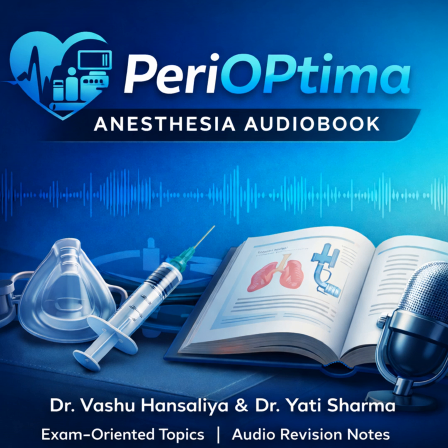That's the danger. Imagine a patient who is in pain and wants to breathe 30 times a minute. In AC mode, they trigger 30 times. The machine gives them 30 full 500 milliliter breaths. That is a massive amount of ventilation. Hyperventilation. Severe hyperventilation. They'll blow off all their CO2 and develop a severe respiratory alkalosis. Plus, they might be breathing so fast they don't have enough time to fully exhale. That leads to air trapping, or what we call auto-PEEP. So to solve that problem of breath stacking and hyperventilation, we have SIMV, synchronized intermittent mandatory ventilation.